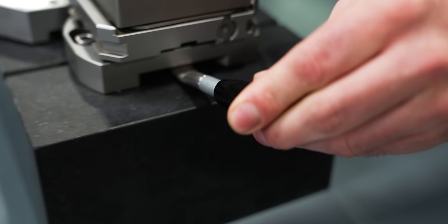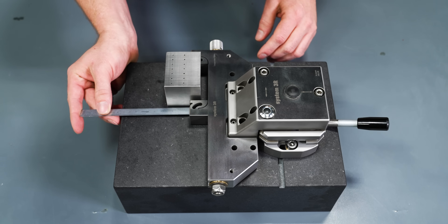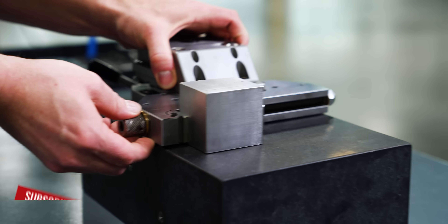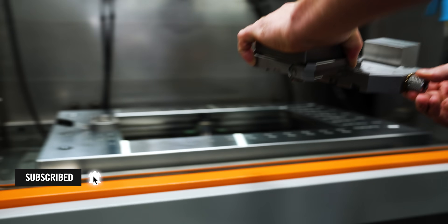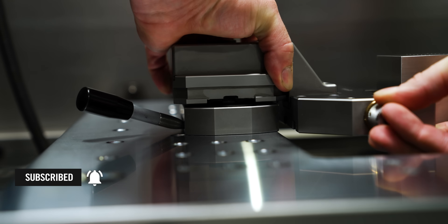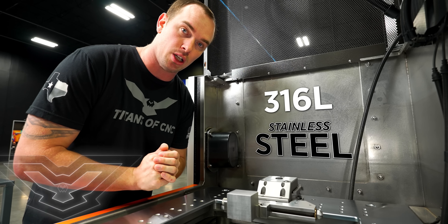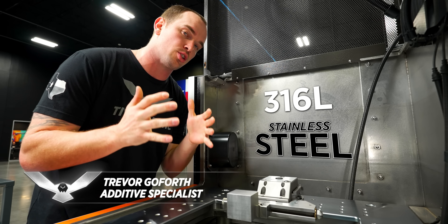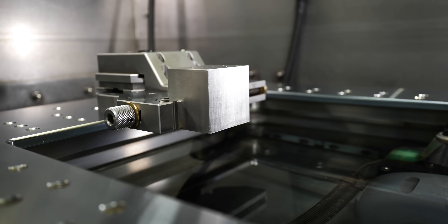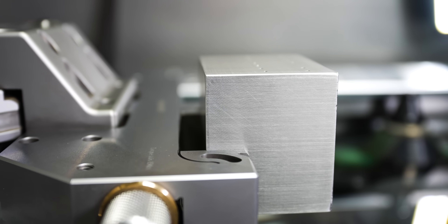Today I'm going to use my wire EDM to machine life-saving medical instruments known as laparoscopy grippers. The most common material types for this application are 316L and 304 stainless steel. 316L stainless has two to three percent molybdenum content, which gives us additional corrosion resistance in saline environments. For that reason, today we're using 316L stainless steel for our laparoscopy grippers.